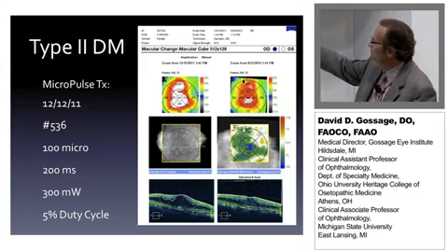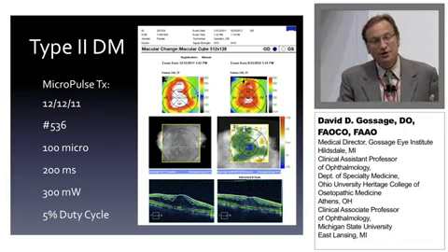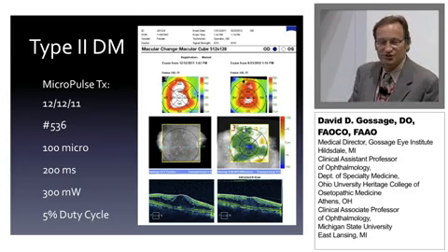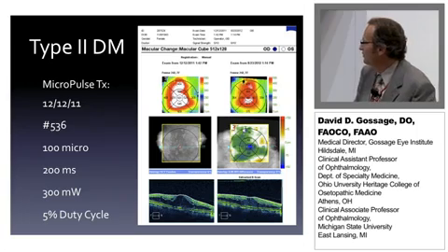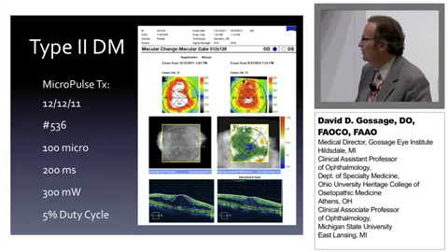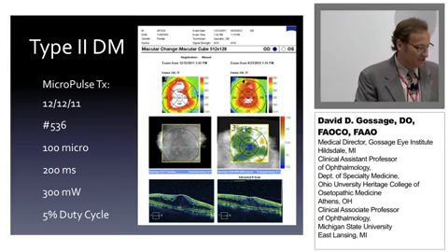It's not perfect yet, but definitely a lot of resolution of her macular edema, where before she was still having this chronic edema that she couldn't get rid of, and she just didn't want any more anti-VEGF treatment. So the MicroPulse mode did help lower the amount of edema essentially and reduce some of the metamorphopsia that she has.